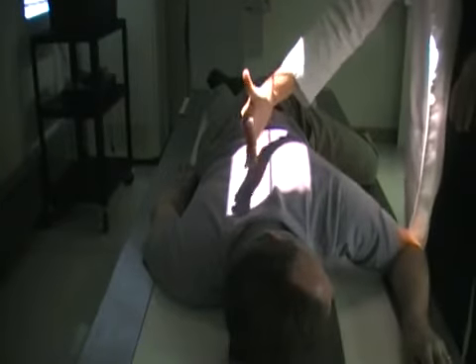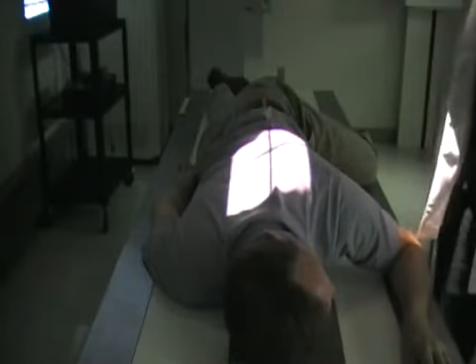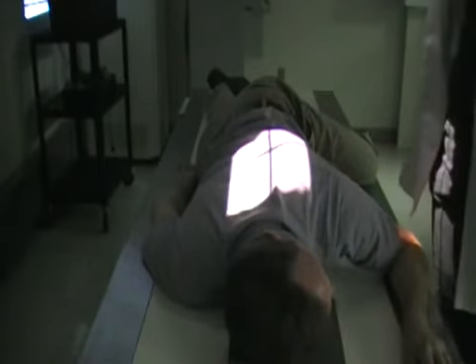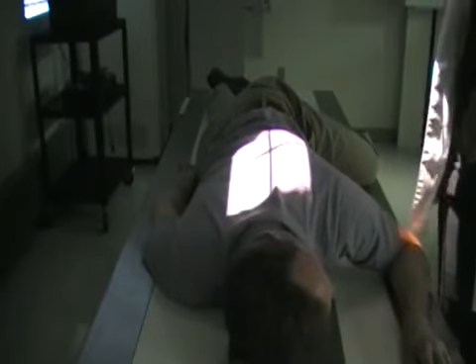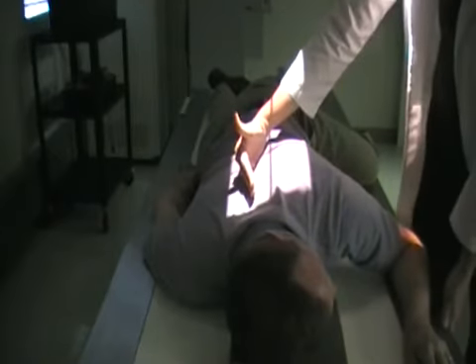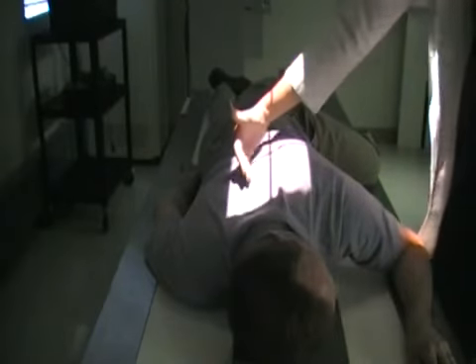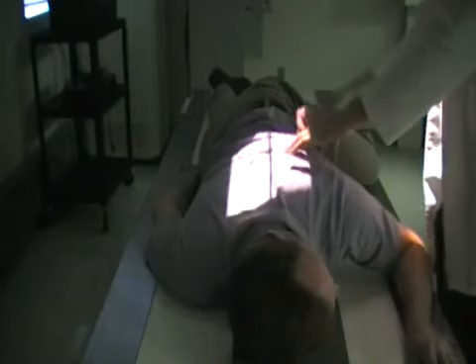And what this does is project the sternum out from the midline of the body so that you can see it projected with the heart as a backdrop for the image. So, palpate for the spine, and our longitudinal line is going to be 1 inch on the upside, or 1 inch out laterally. Our transverse line is going to cut across the tip of the scapula.